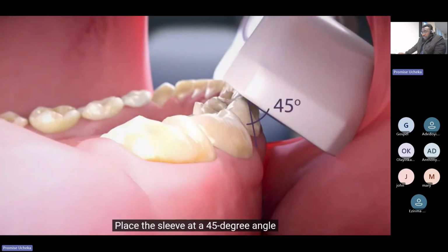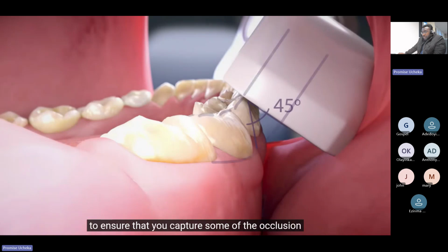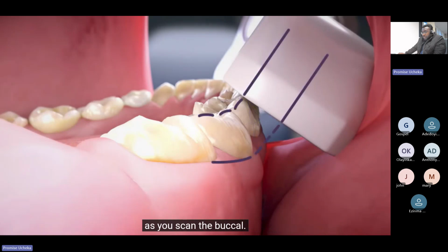Place the sleeve at a 45-degree angle to ensure that you capture some of the occlusal as you scan the buccal.